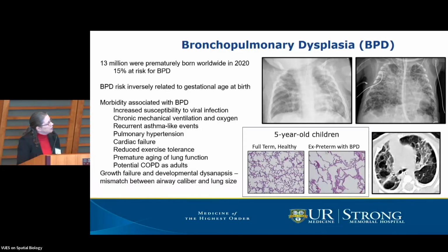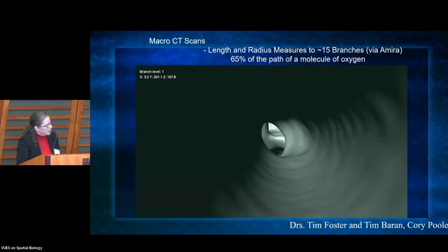One quick picture of 2D to 3D is that upper right-hand chest x-ray that you maybe can tell has too much air trapped in it. It's kind of cystic looking. If we go to a 3D CT image, of which I've only given you a 2D plane, you can see how much more information we gather from that 3D reconstruction, as well as comparing it to the histology on the left-hand side. But again, in 2D, we lack a lot of information about why we have that obstruction in the airway. So for fun, let's take a journey through this reconstructed high-resolution CT scan of an adult lung.